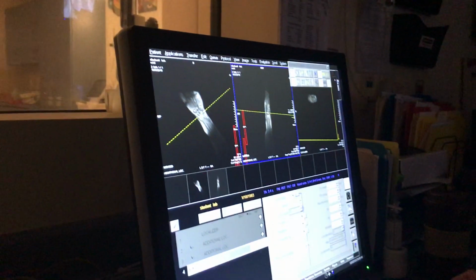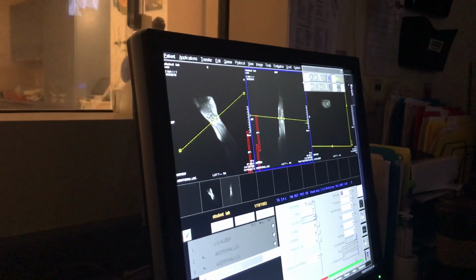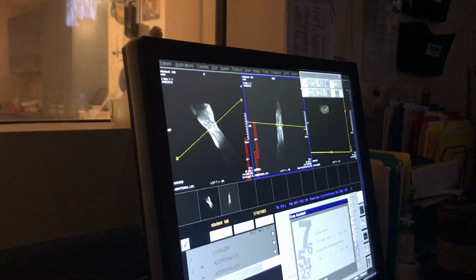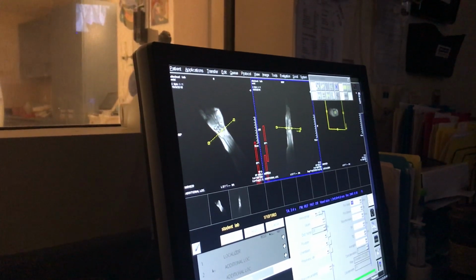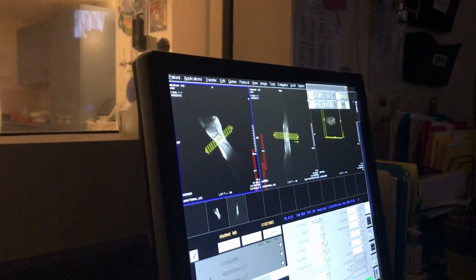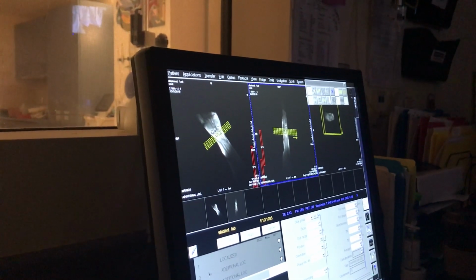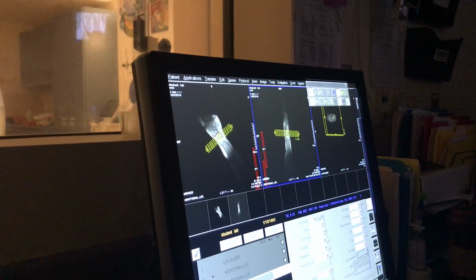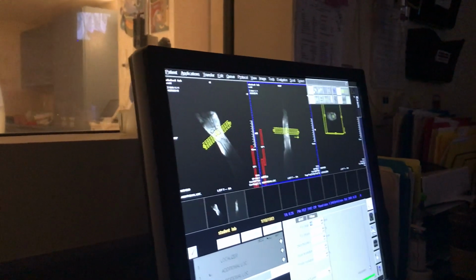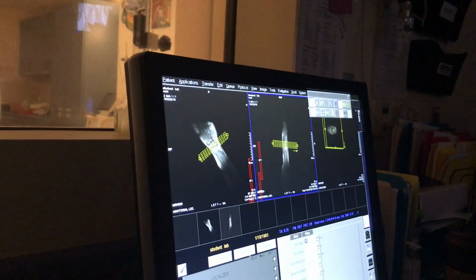Now I'm going perpendicular to the wrist off of the coronal and the sagittal plane. But let's get it so we can actually see some anatomy. So let's shrink our field of view down. Add a handful of slices. Good. And we'll add an average just because we took away a fair amount of signal. We want to be able to see it. But they're localizers, so we're not that crazy concerned about signal. We just want to see the anatomy right now.